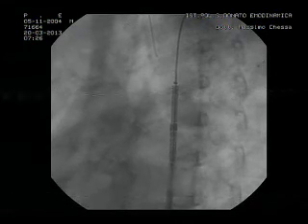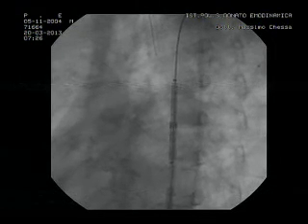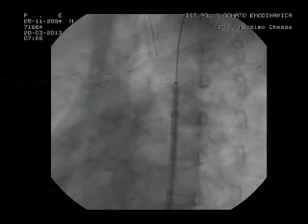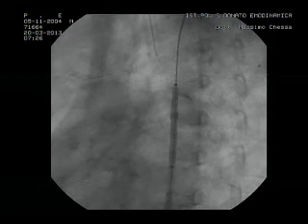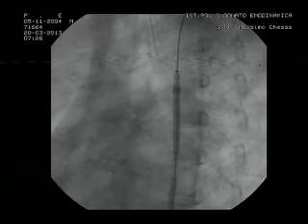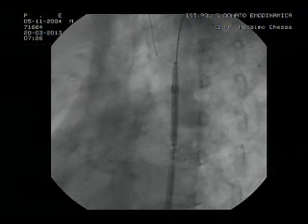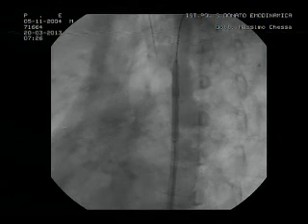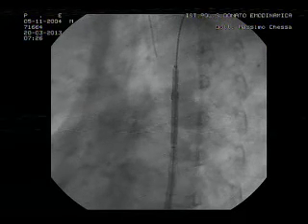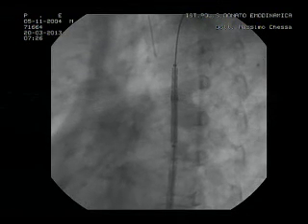Here Dietmar from Gießen, Germany. I have an additional comment to the stent, the shorter one or longer one. But it is most important that you have to be precise in the delineation of the aortic arch. If it is a little bit too high, you can have the risk for infolding over time of this kind of stent. And we have seen this, and it was a real, let me say, high urgency case 2 weeks later. Yeah, that's right. However, based upon both the angiogram and the CT scan we see, the isthmus is rather straight. So I think my wish, Massimo, is to expand the stent just at the end of the subclavian.